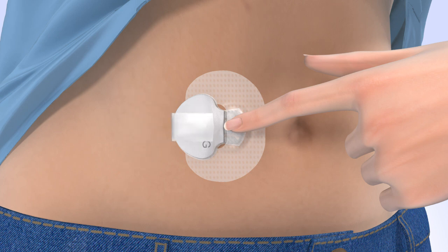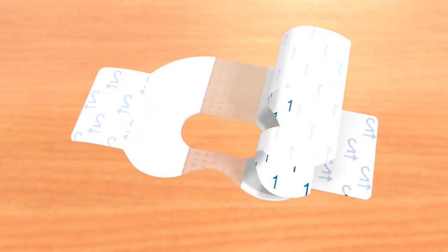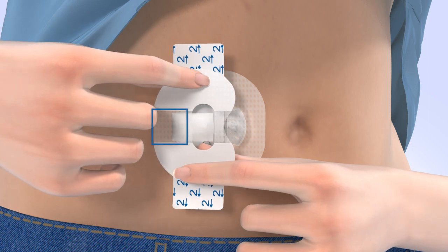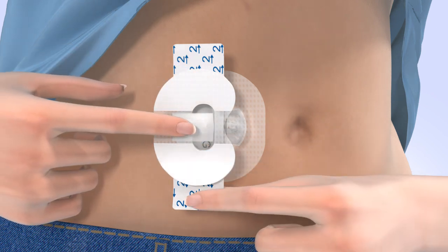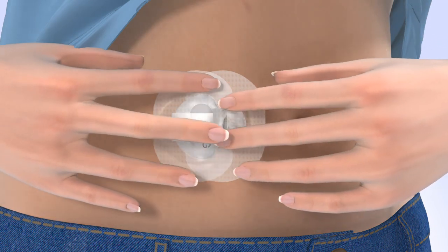Now you need to apply a second piece of oval tape to the transmitter. Remove the paper backing marked with the number 1. Rotate the tape and place it over the transmitter. The wide part of the tape should cover both your skin and the back of the transmitter. Smooth down the tape and remove the paper tabs marked with the number 2 from the sides of the tape. Smooth the sides of the tape.